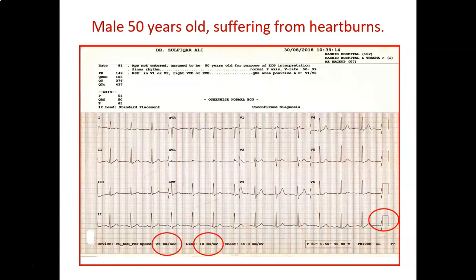Here I'm going to apply the 7-step approach on this ECG. The purpose of this small segment is not to teach the whole ECG, but just to sensitize how we are going to apply this checklist on an ECG. This ECG belongs to a 50-year-old man who is suffering from heartburn.